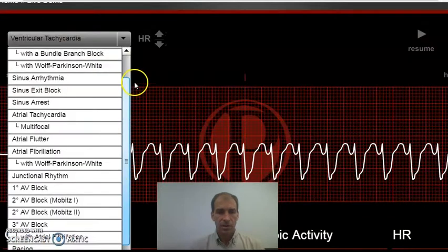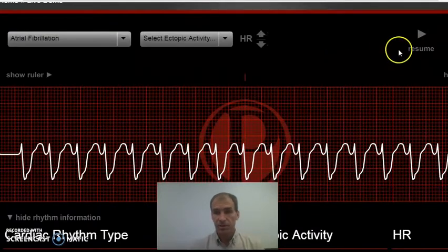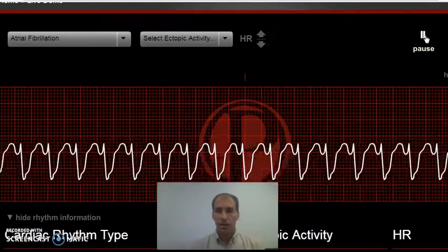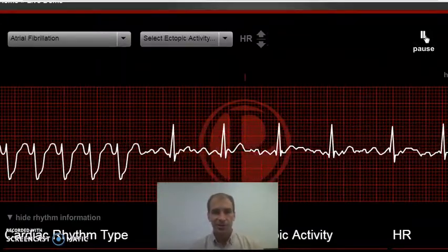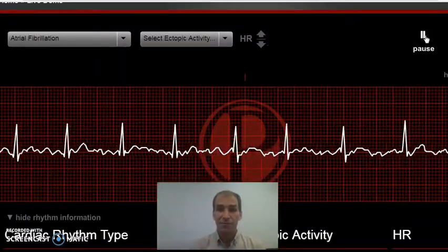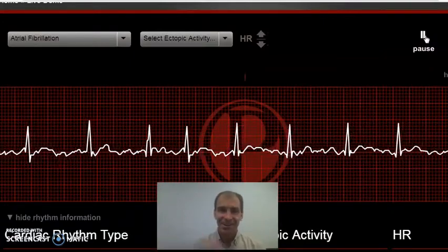Let's see, what other good stuff? Atrial fibrillation, I think we can do that. Yeah. So atrial fibrillation, this is really common. You probably see commercials on this, medications to help with your AFib. That's not a lie, AFib, lie, get it?